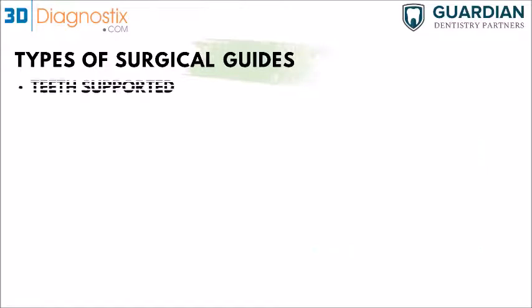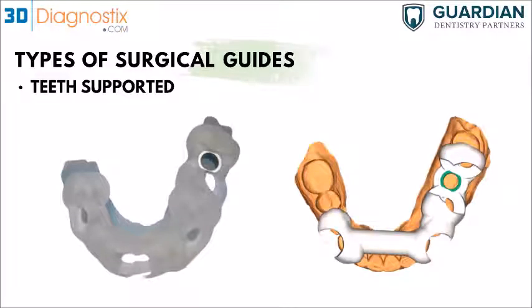So teeth supported guides, this is how they look. On the right side, this is a virtual design of the guide. You can see that right here, we have the acrylic support rest on the teeth. So the entire support is going to be from the teeth and nothing else but the teeth. And on the left side, this is how the surgical guide is going to end up being after printing it. And then once we've got the surgical guide printed, we glue in the sleeve and then make sure it's seated on the patient's model well before sending it and making sure it passes QC, and then we send it to you.